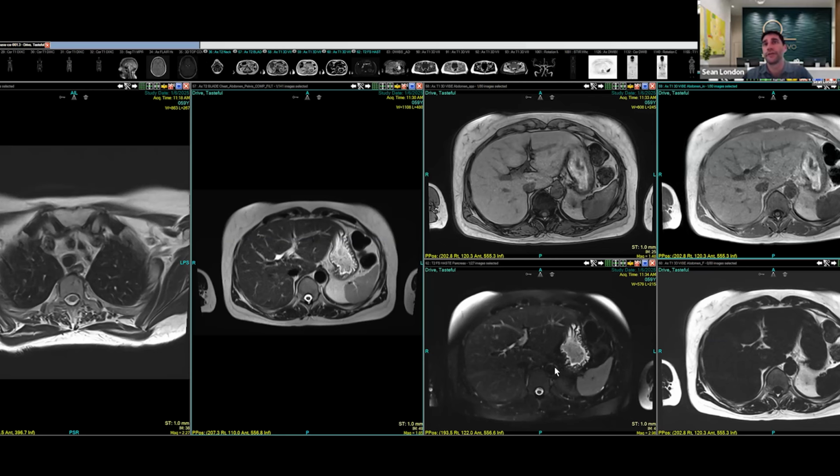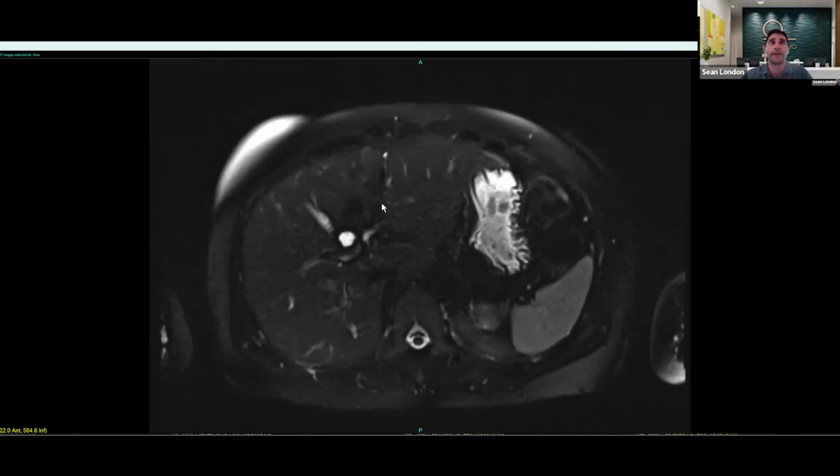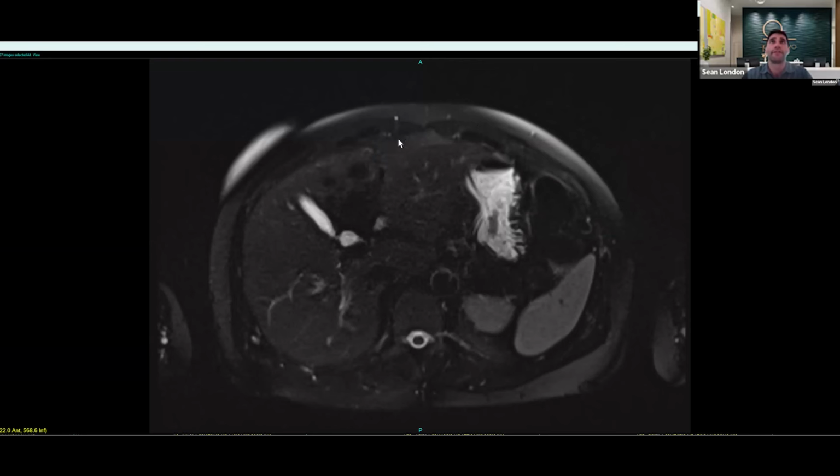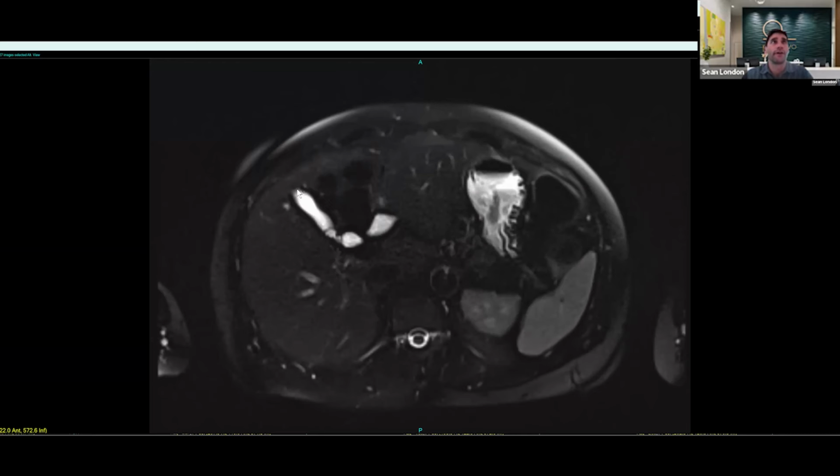The next thing I do is I look at the gallbladder, the bile ducts, and the pancreas. As I come down here, this set of images is designed to highlight fluid, which shows up as white signal or color. Here is the gallbladder that lives under the liver, and it's nice and white. The most common thing that I see in here are gallstones. They look like black rocks. They're really common. Many of us walk around with them and we don't even know.